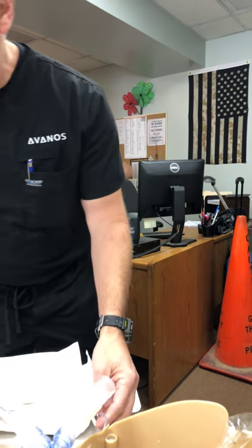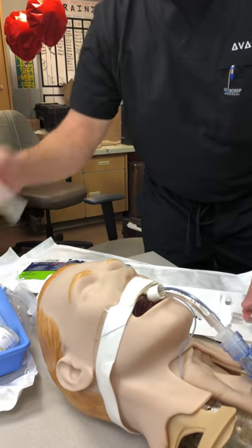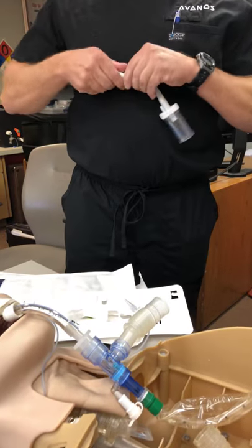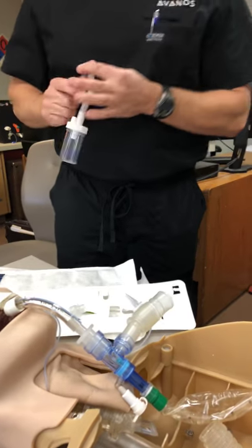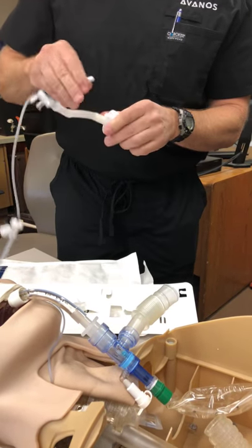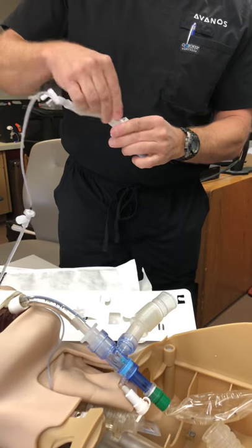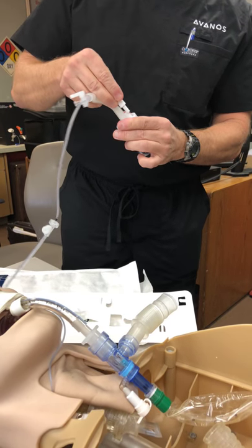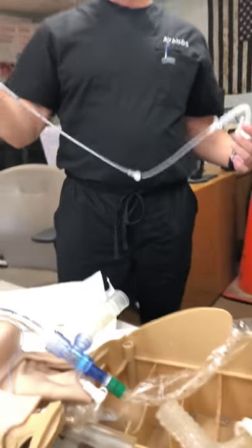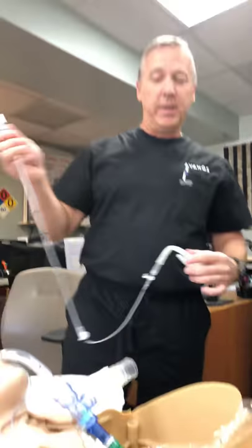And then we would take our Luer-lock strap and we would start connecting this component here. I've used this before, so it works pretty good. We would connect that, and then we would connect this to wall suction. Now our mini-BAL is all set up, connected to wall suction, and connected to our ET tube adapter.